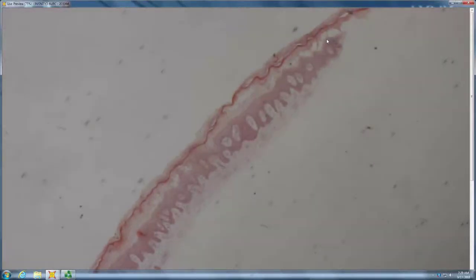Just have shade. It's like orthokeratosis on top. It's hard to tell. It actually shows up a little better up on the screen, I think, than on the scope. Pallor of the upper, like of the stratum spinosum. I think like nutritional deficiency. So pallor and edema of the upper third of the stratum spinosum, like nutritional deficiency.